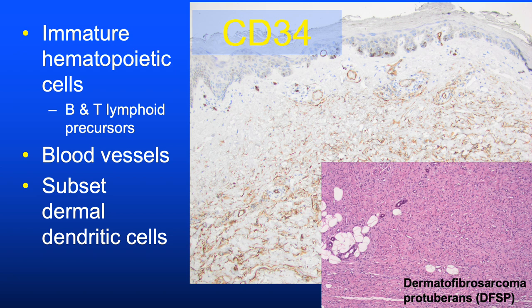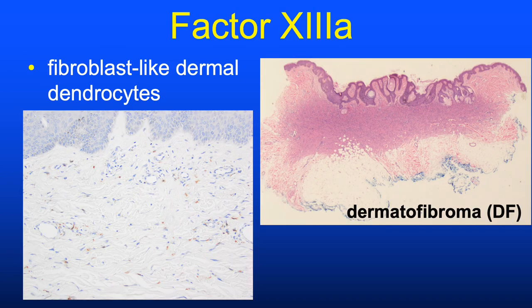The immunostain shown here is of normal skin. Because DFSP frequently enters the differential diagnosis for the far more commonly encountered benign dermatofibroma, we often think about factor XIIIa as a marker for dermatofibroma and CD34 for DFSP.